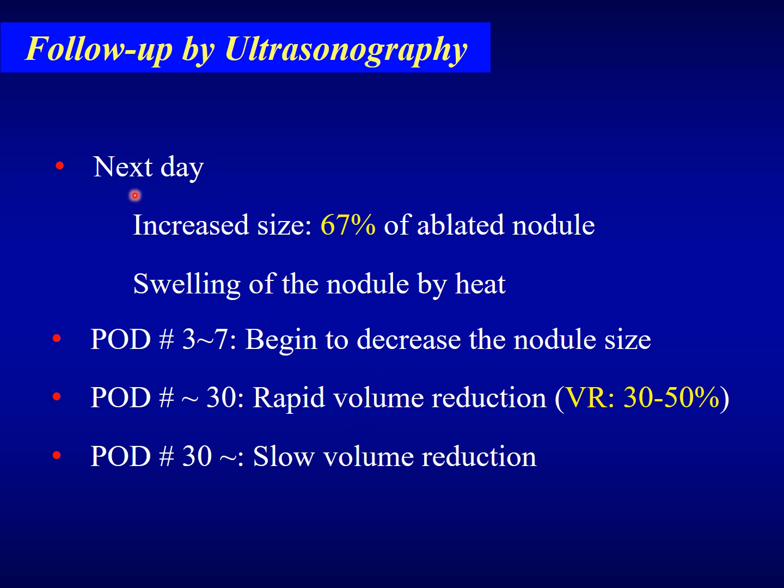On the next day of RF ablation, the ablated nodule increases in size because of swelling of the nodule by heat. Around 1 week, the treated nodule starts to decrease in size, and rapid volume reduction is achieved during the first month after RF ablation. After 1 month, nodule volume reduction is usually slow.